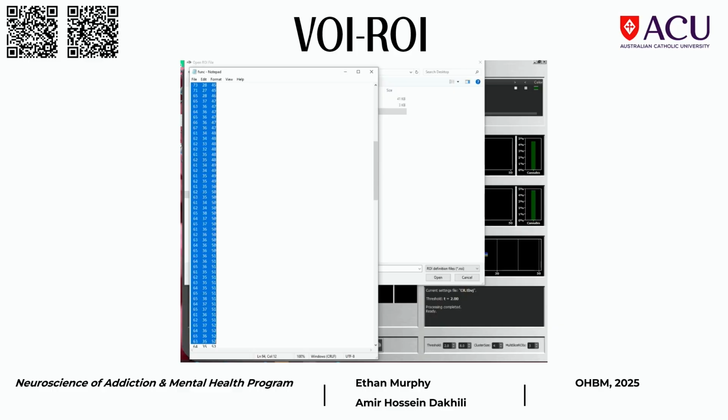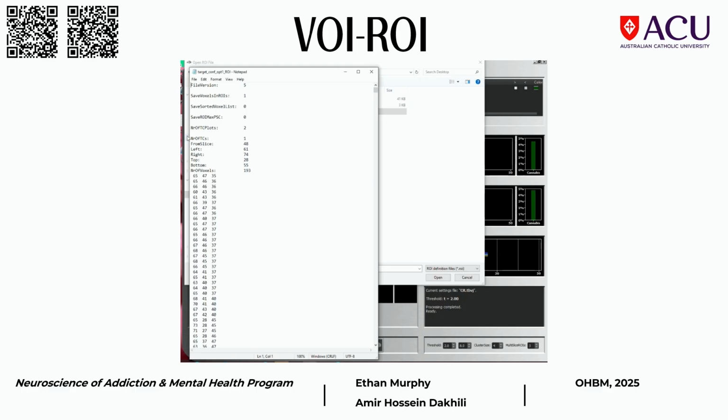There's a little line at the very bottom that says max PSC equals 1.5 or whatever it's been set as, and transferring that crashes TBV. So something as small as that is going to mess up your whole experiment. We didn't really know what was going on for a while. But yes, it is the template file.